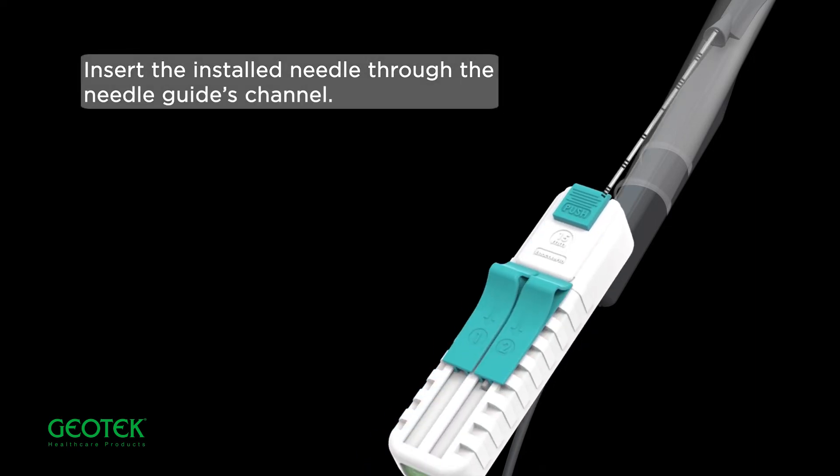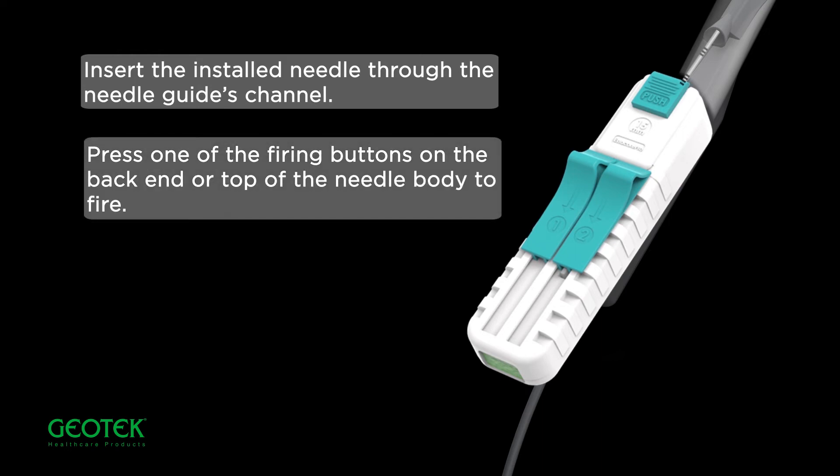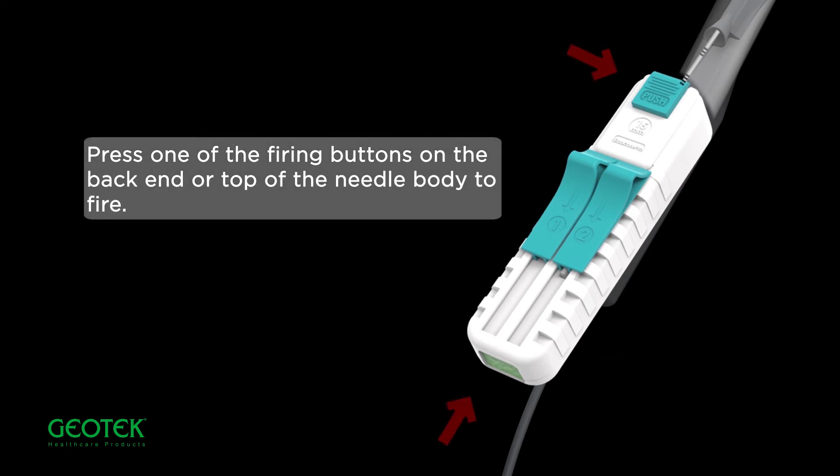Insert the installed needle into the needle guide's channel. Press the firing buttons on the back end or top of the needle body to fire.